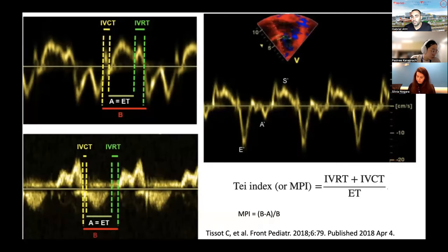It's used a lot in the literature on chemotherapies, like anthracycline-related toxicity to the heart. So more and more, this has been integrated in some of the comprehensive assessments of RV and LV function to try to better delineate subtle changes in the function of the RV or the LV in various disease states. It's definitely something we measure in our research echoes, but I must admit clinically, it's something that I don't necessarily use personally on a daily basis.